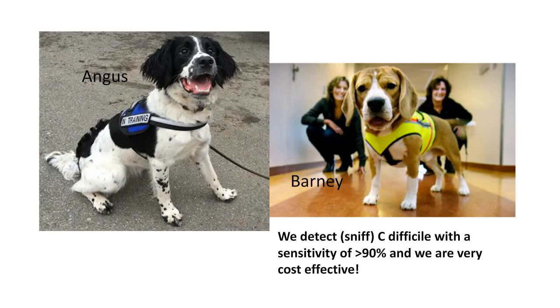So our first question, we are currently trying to reinstitute EIA GDH testing at our facility. A lot of Orange County hospitals are using PCR testing in addition if the test comes back antigen positive and toxin negative. What would be the theory behind using PCR testing for this algorithm? Would not PCR testing still catch colonized patients?